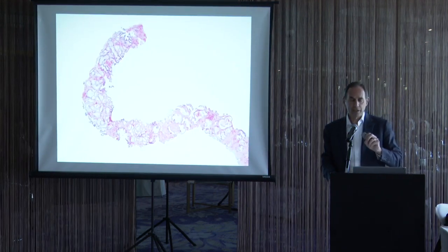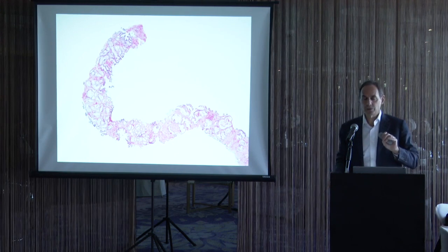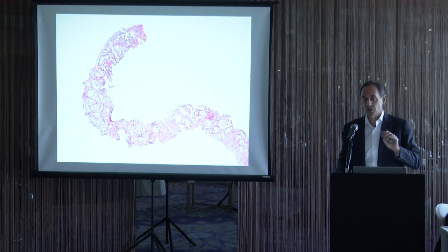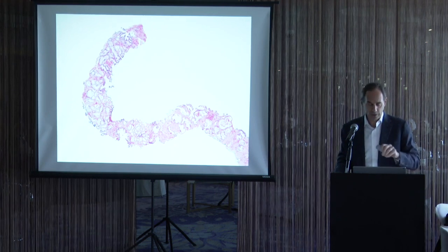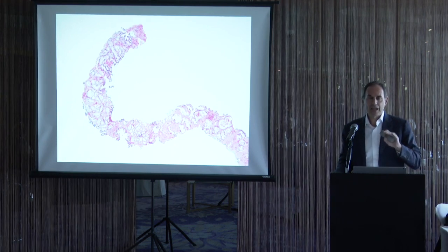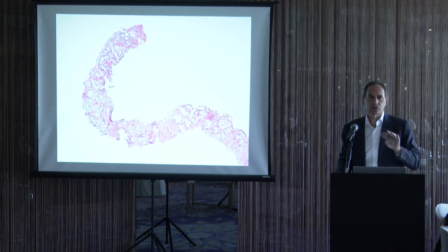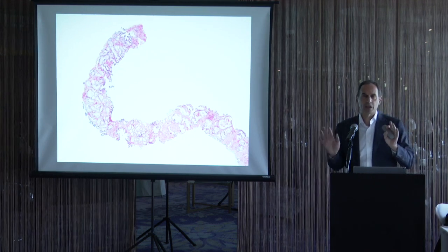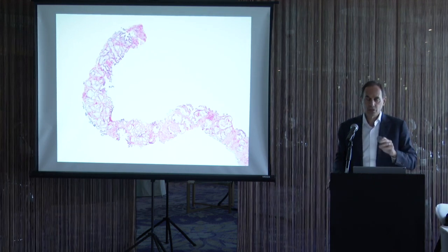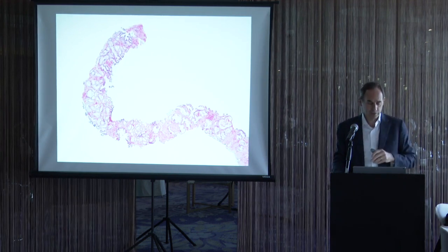Very uncommonly, you diagnose cancer when you have nothing else other than the architectural pattern. But I would warn you to be very cautious in that setting, because as I'll show you, both on the slide seminar and on one of the photomicrographs, you can have adenosis, for example, occupying 90% or 100% of a core, looking as crowded as cancer, that if you just looked at it as a gestalt, you would say, oh, this has to be cancer, and you would be wrong. So you have to be extremely careful, and that's why you look for specific architectural and cytological features.